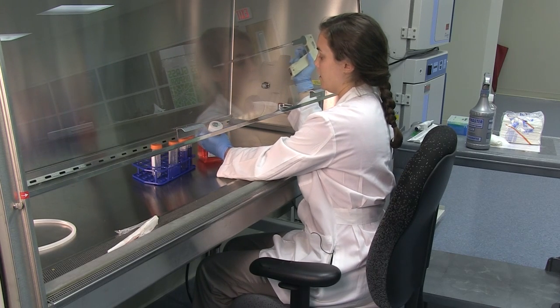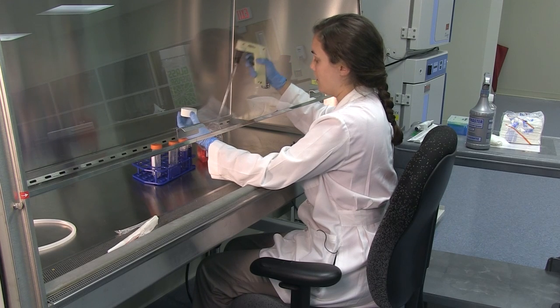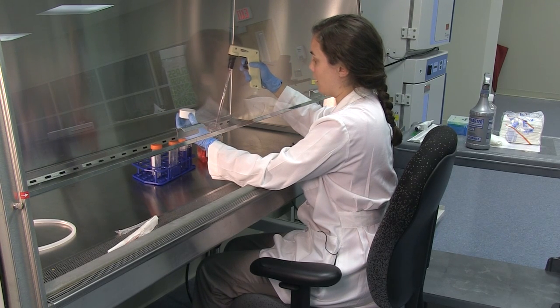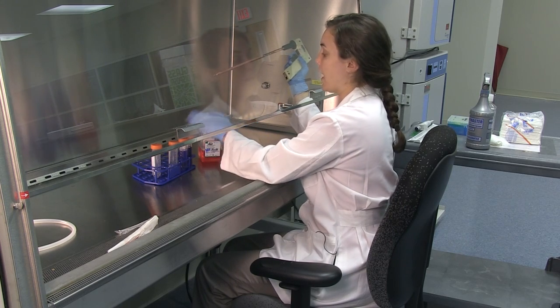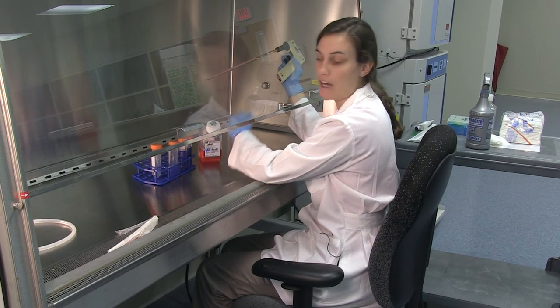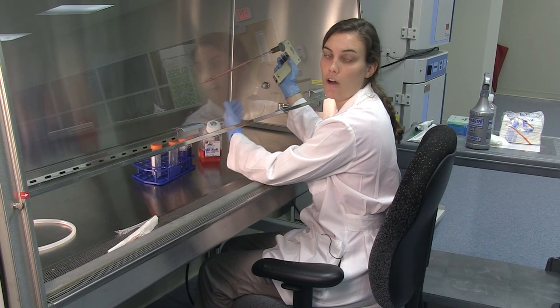Now that the media is open, use one hand to take off the cap of the media and use the other to draw out the media. When you're finished, you can put the cap back on. It's important not to pass over the top of the media bottle or any open container without the lid on, because this can cause contamination.